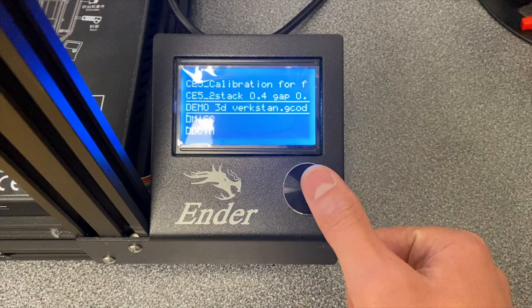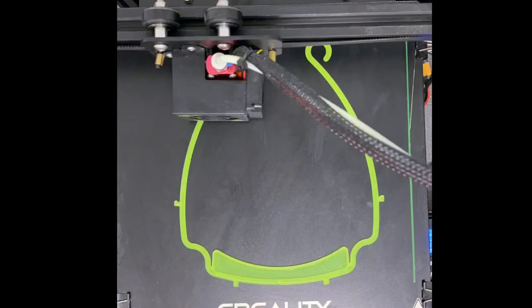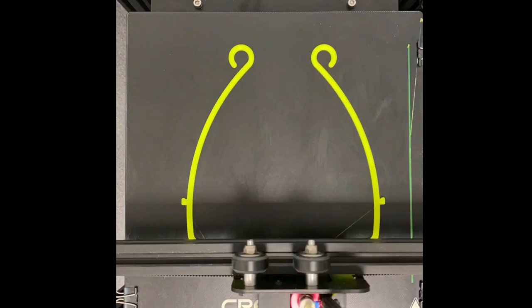We start the print. The printer's extruder travels along the build surface based on previously programmed instructions. It continues to melt plastic and deposit it in subsequent layers on the build plate.